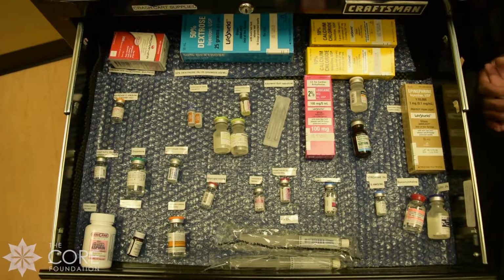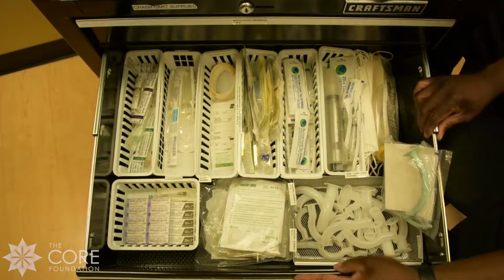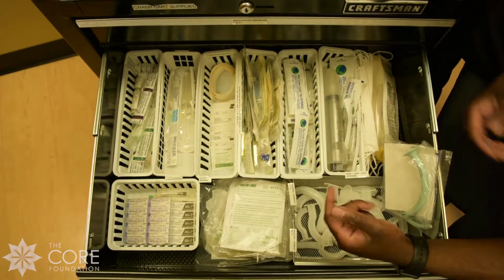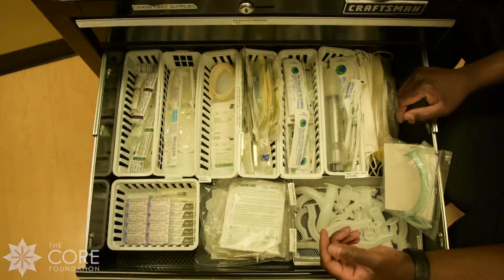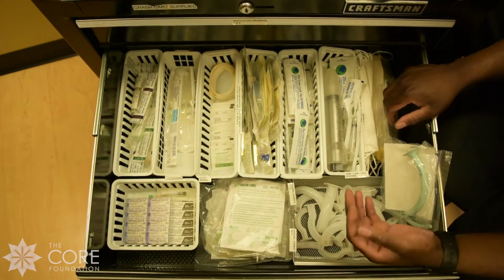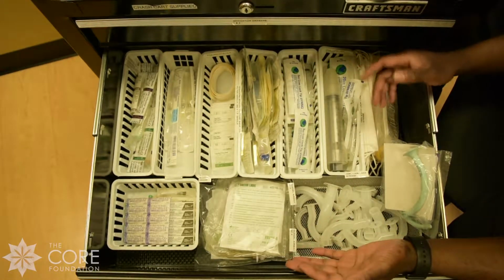We tend to do a lot of other stuff like oral surgery, or we have an OR where we put kids to sleep, so we have more anesthetic. Again, it's based on what office you work at and what your doctor prefers. Next, we'll have the different syringes. We have a 5cc, 10cc, and 20cc. We also have some masks, and also the catheters in here, and then we also have some needles and also some alcohols to wipe the hands before you do anything.